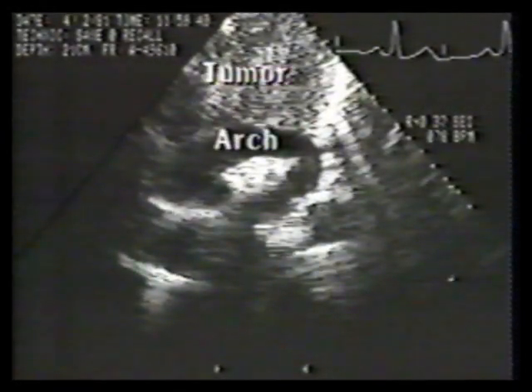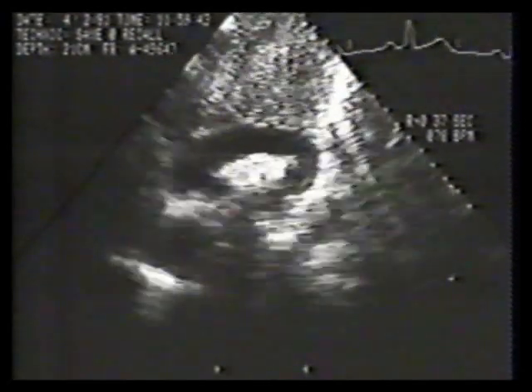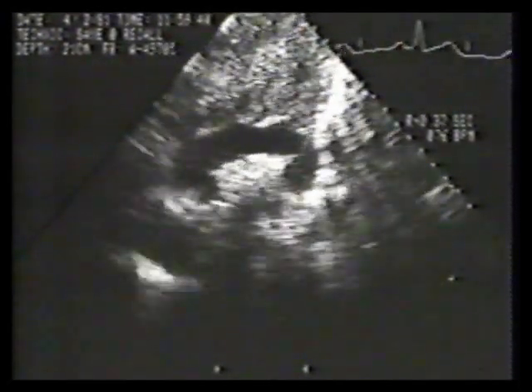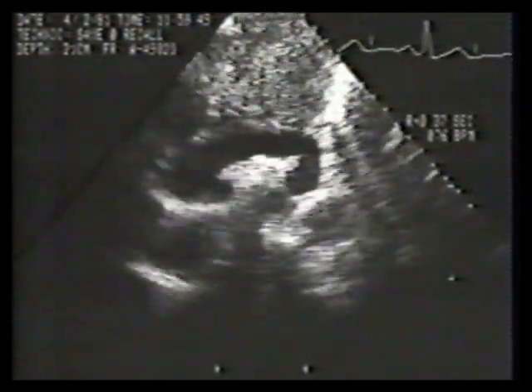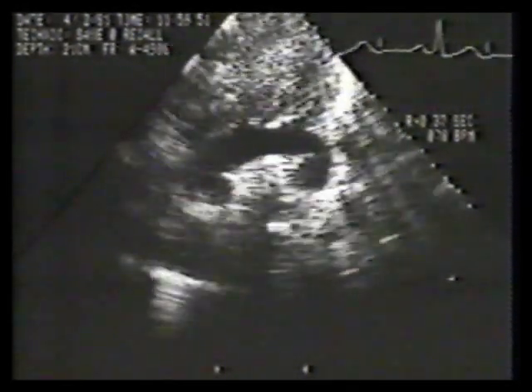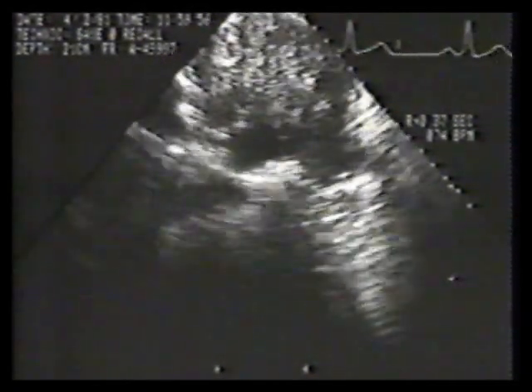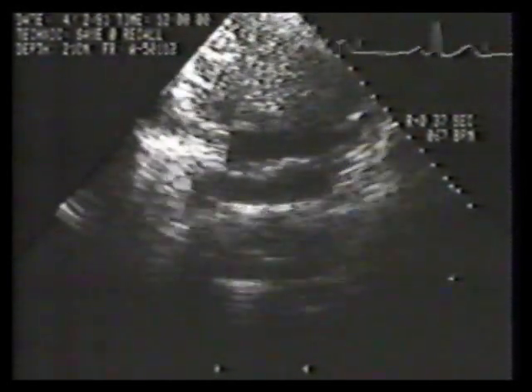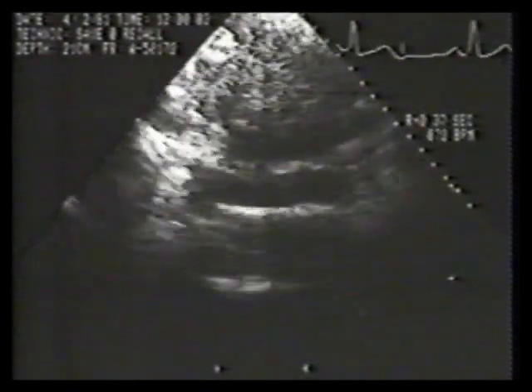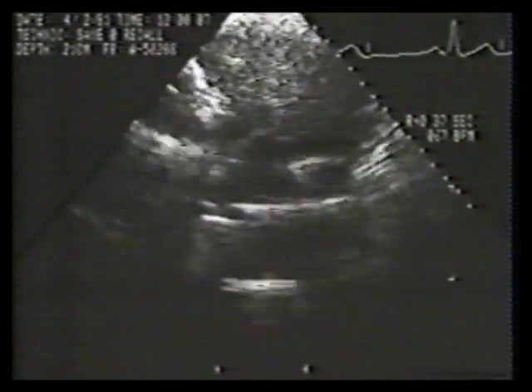In this same patient, the suprasternal examination highlights the extensive nature of this anterior mediastinal tumor mass. The aortic arch is displaced far posterior, and the brachiocephalic vessels appear to be elongated and stretched. The tumor mass extends far up into the upper mediastinum and partially compromises the brachiocephalic vessels, the aortic arch, and the pulmonary arteries. This was an example of a large lymphoma of the upper mediastinum.